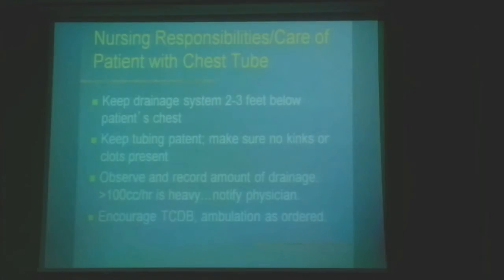What else? Nursing responsibility. We have to make sure if there is drainage or no drainage, bubbling or not bubbling. Oscillations or not. You have to check if the system is intact or not. Suppose it's disconnected from the connection. The air will come inside the patient again. Right? And what else? Checking the site of the insertion. Is it intact or not? Maybe it's inflamed and we cannot see it because of the dressing.